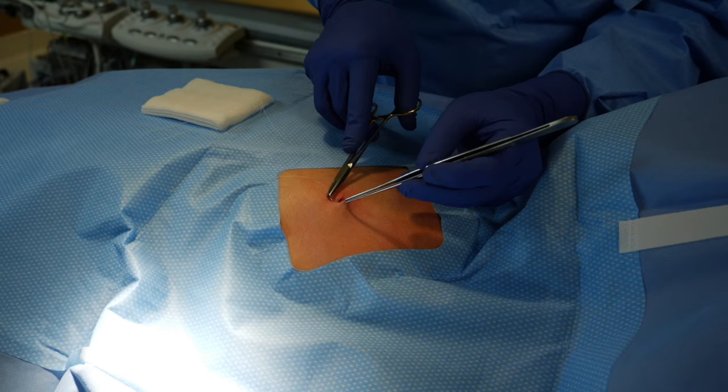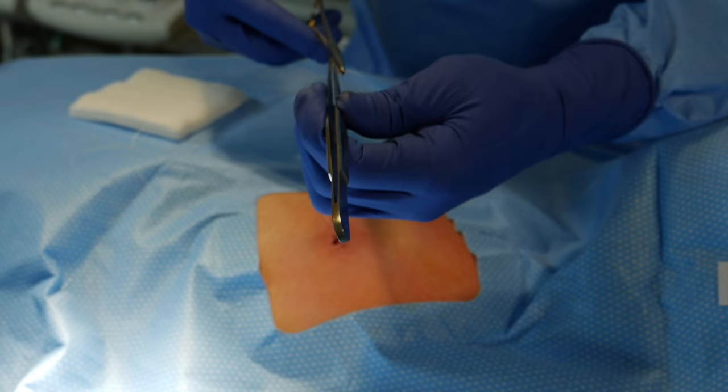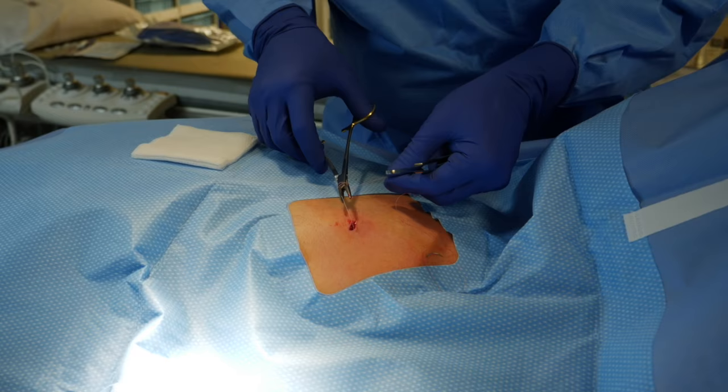We can program it to send us any alerts for things that we may need to be aware of immediately. We now close that insertion site with resorbable sutures. We'll position several sutures under the skin to hold that securely closed, allowing the wound to heal in a very satisfactory fashion.